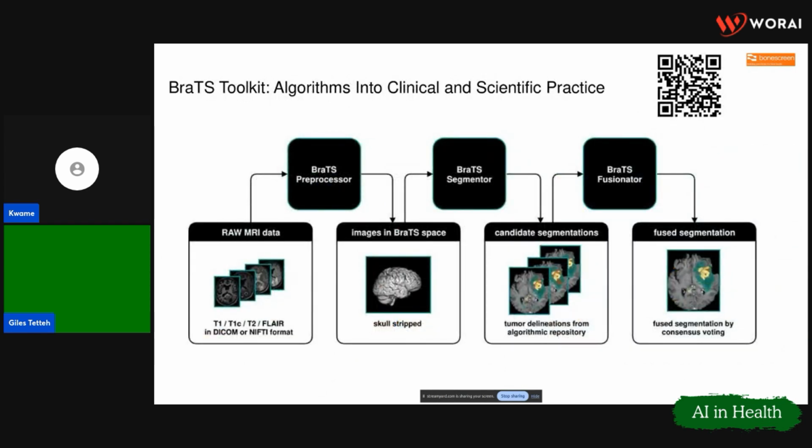And we tried this in our group and created a software. You can look at the paper on this software here, which tried to fill in the gap. But this was specifically for only this task, which was the segmentation of tumor within the brain from this data. So this was the first step. We have a paper on it if you are interested.